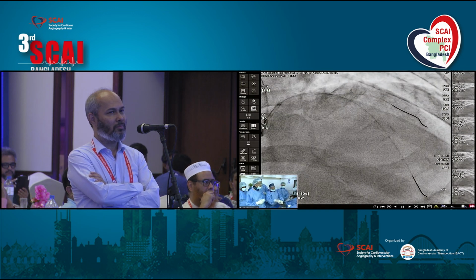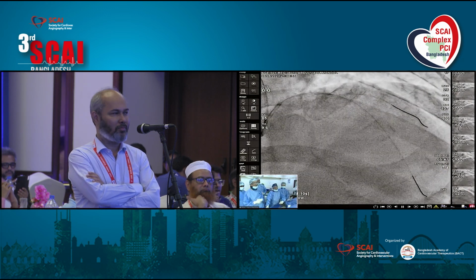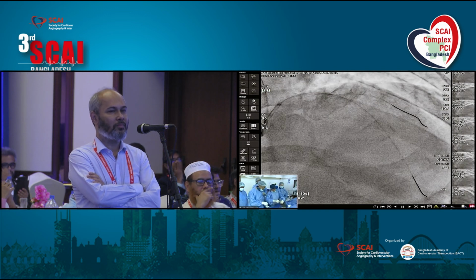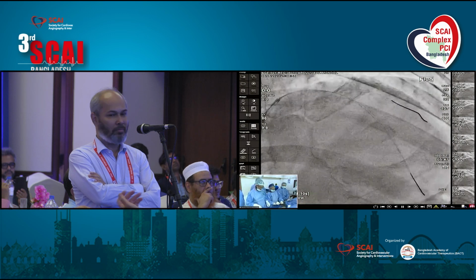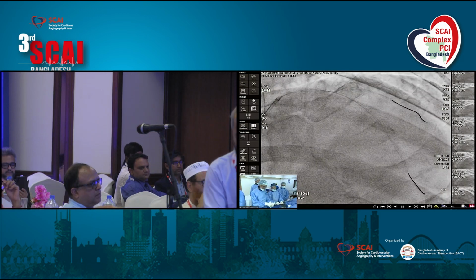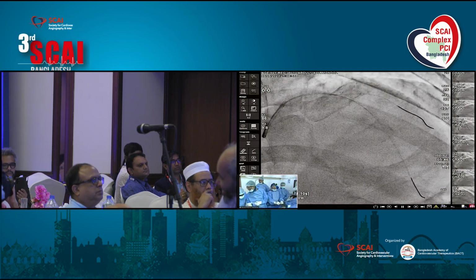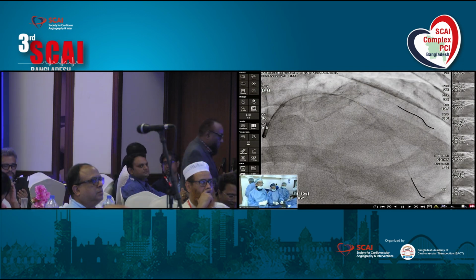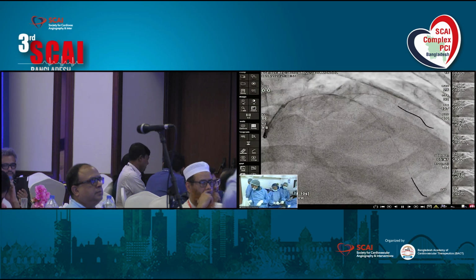You are talking about the LAD lesion covering, yeah? Or diagonal? LAD. Yeah. If we were using DCB here, the way I would do it is use a scoring balloon or even an NC balloon inflated for at least 30 seconds. That prevents the recoil, and a scoring balloon will certainly help in preparing better. Then you reassess before you use DCB. If there is a lot of dissection with flow limitation or recoil, then stent. For your information, de novo large vessel, though it is done with DCB, there is no randomized controlled trial for de novo large vessels using DCB.